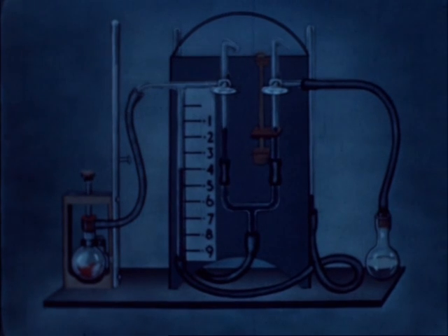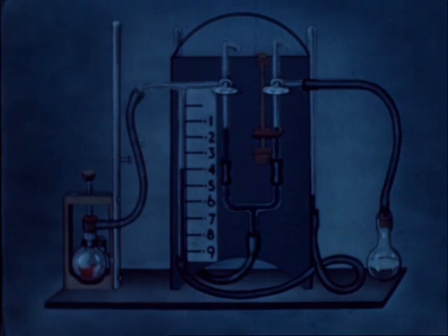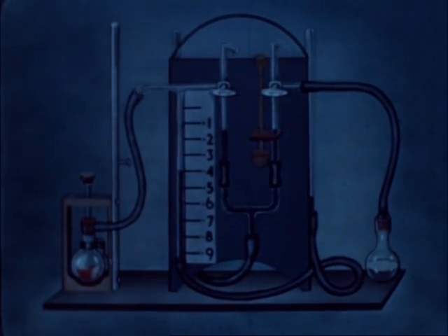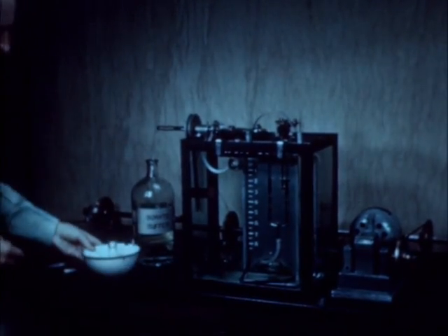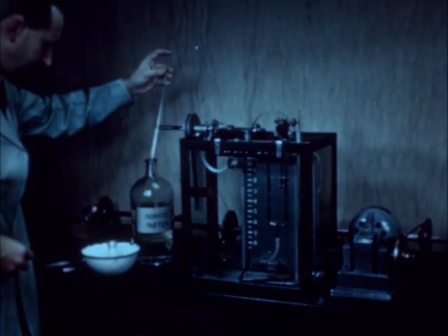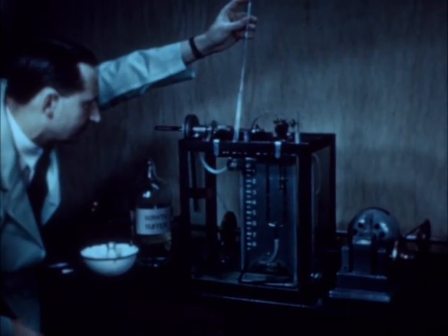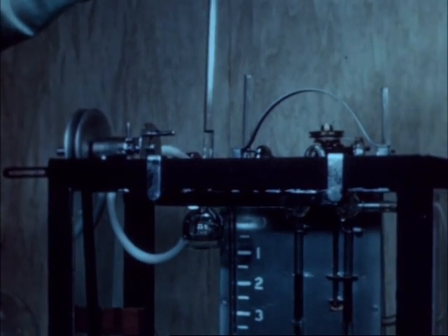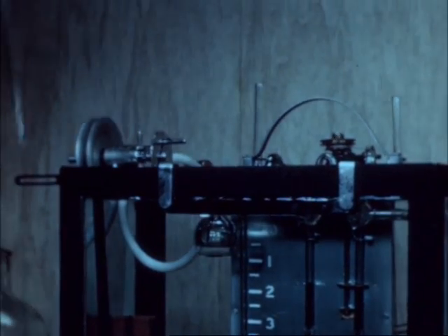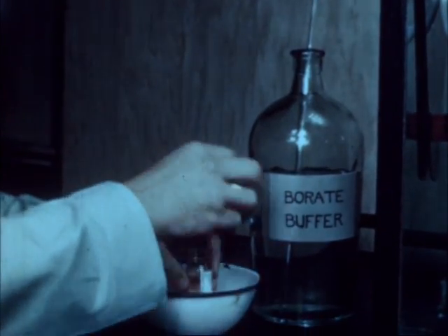Any changes in temperature and pressure which take place during the procedure are automatically compensated by a control bottle exposed to identical conditions in the water bath. In actual practice, 3 cubic centimeters of alkaline borate solution are introduced into the Haldane bottle. The blood sample is again stirred to avoid errors resulting from sedimentation.